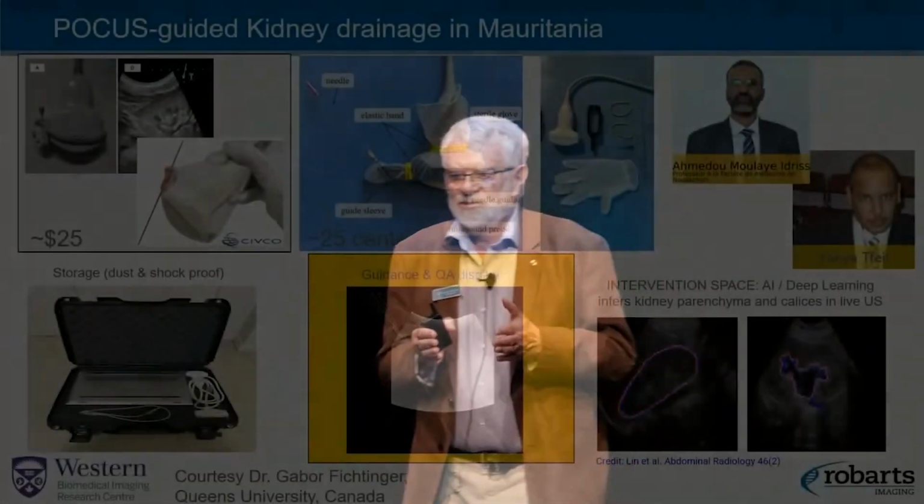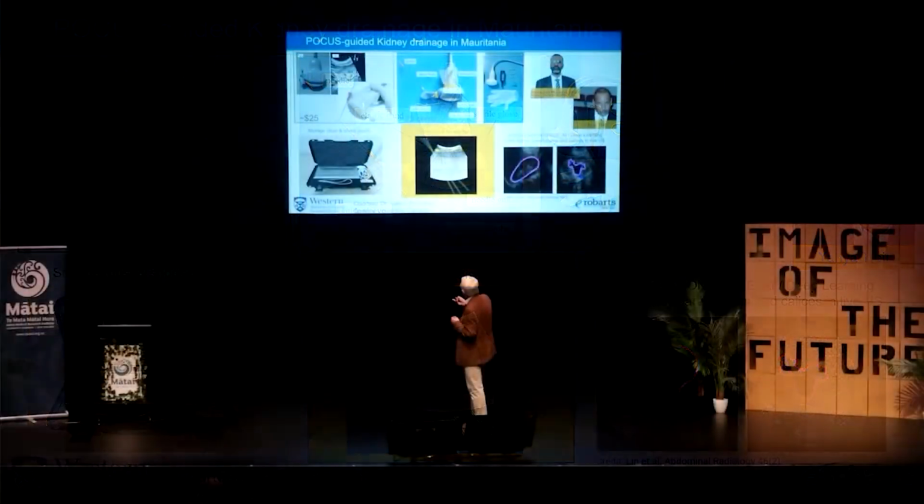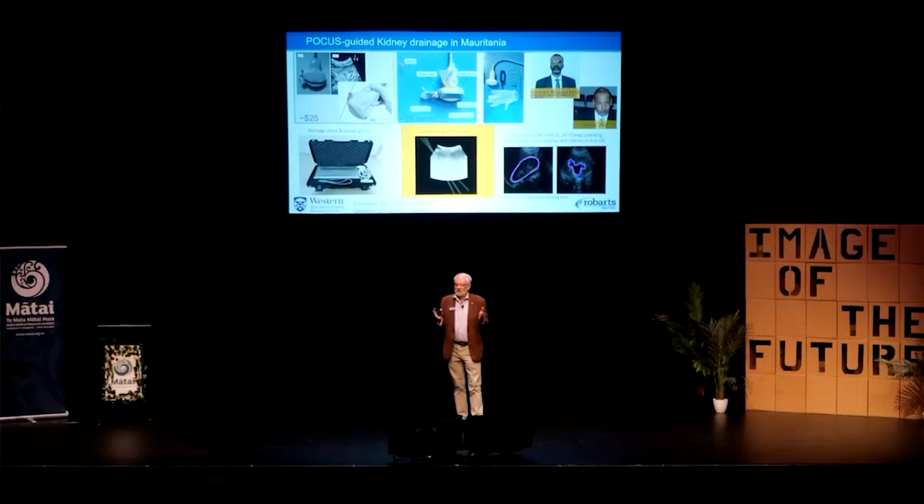I just want to end up with a couple of examples from a very good friend of mine, Dr. Gabor Fichtinger from Queen's University in Kingston, Canada, also in Ontario. He's already been engaged in a number of projects in Eastern Africa using 3D Slicer and POCUS to address very real needs in countries like Mauritania. Even in this particular example, they started off using a commercial add-on to this ultrasound probe that consisted of a needle guide that would allow the needle to be tracked to go to a point that could be seen in the ultrasound. But even this at $25 a pop is too much for certain under-resourced communities.